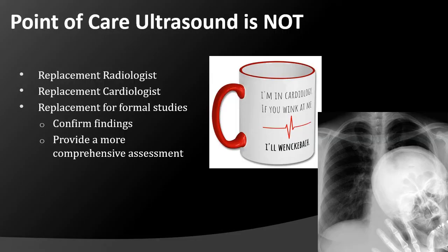Point-of-care ultrasound in general, and this course specifically, is not going to turn you into a replacement radiologist, nor is it going to turn you into a replacement cardiologist. Your examinations should be confirmed with formal studies at a later date. Formal studies are going to A, confirm your findings, and B, provide a much more comprehensive assessment of whatever organ or area is being interrogated.